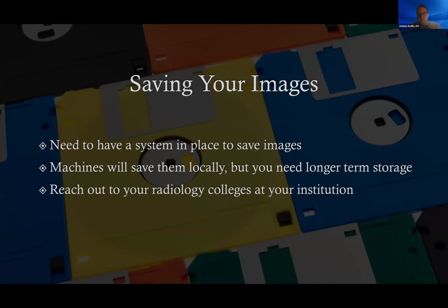And what about saving your images? You need to save your images, just like radiology needs to save their images. Machines will save them locally, but you do need longer term storage. If you don't have something like that already in place for your EMG lab, I recommend reaching out to radiology at your institution. A lot of times they're going to set things up in a cloud, and you're going to eventually dump the hard drive and move it over to that. But you need that to be set in place, and it needs to be secure. So again, I rely on people that already do it. Your radiology colleagues already have a lot of expertise, and there's probably a lot of infrastructure all set up. Just tap into it.